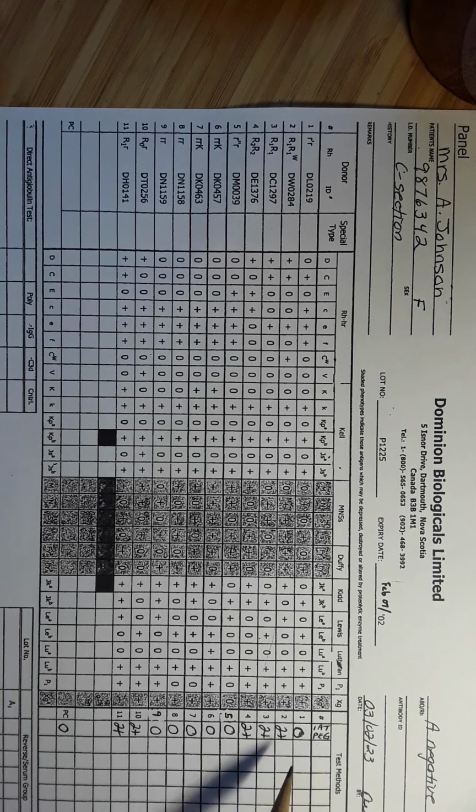So we can see here for Mrs. Johnson that the reactions are listed here. This patient's plasma with panel cell 1 did not react. With panel cell 2, her plasma did react, and so on. So please have your module open to page 9, and we're going to get started on the process of identifying the antibody by excluding antibodies that we do not think are present.